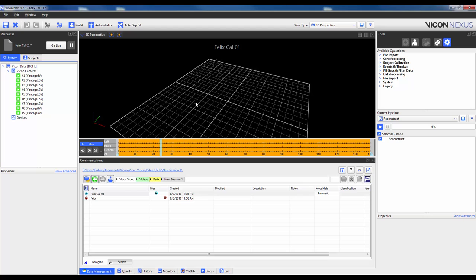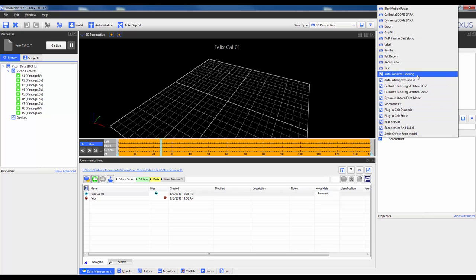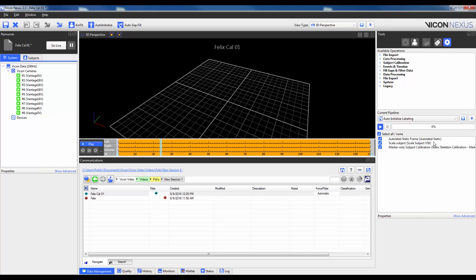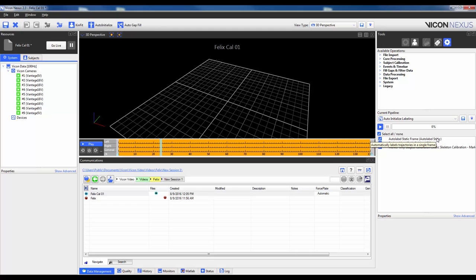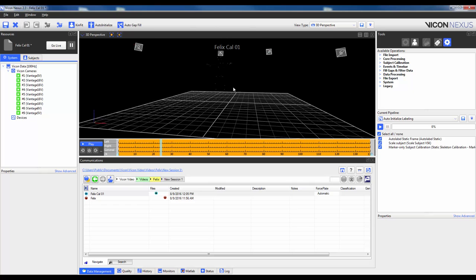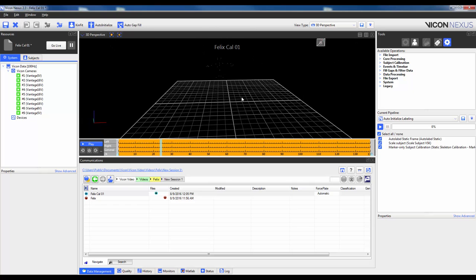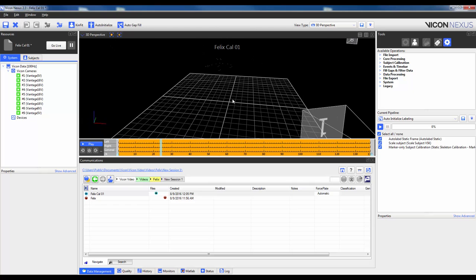With the markers reconstructed, I will then run the pipeline termed Auto-Initialized Labeling. This pipeline calibrates the template, i.e. the VST, and creates the subject-specific VSK or labeling skeleton. If I navigate to the Pipeline tab and change to Auto-Initialized Labeling, you will see that it consists of three steps. The first is Auto-Label Static. As the name suggests, it will automatically label a single frame within the calibration trial. By default, this will be the current frame you are on. Before running this operation, it is important to check that all the markers are there and there are no ghost markers near the subject.